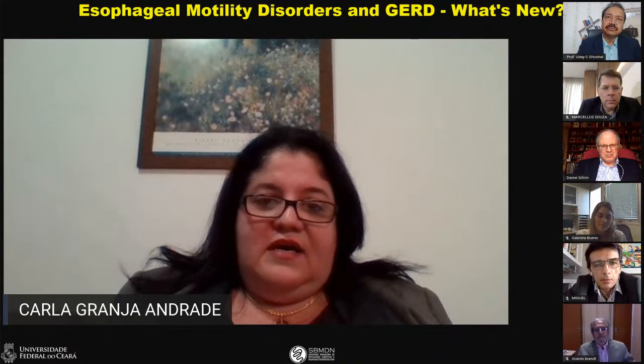Yes. We have frequently seen these alterations in patients post-operative gastric sleeve gastrectomy, and the situation is that sometimes we see intragastric pressure elevated, and sometimes we do not. Maybe 50% of these patients have intragastric pressure elevated. I think the provocative test is a good way to test these patients and intragastric pressure in these patients.